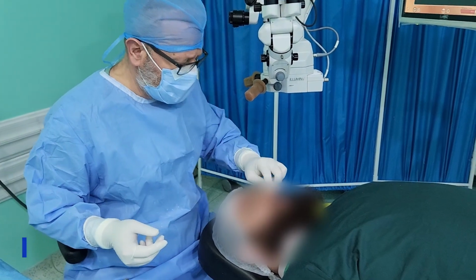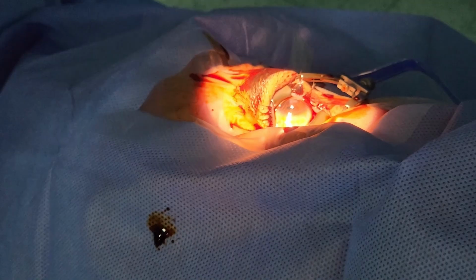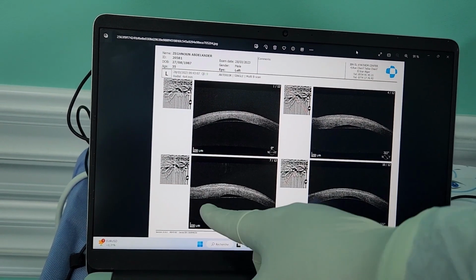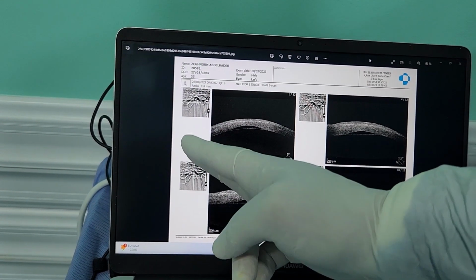The treatment chosen in this case is mainly surgical. Two vertical deep corneal sutures were performed under topical anesthesia to bring the edges of the Descemet and/or the Dua's membrane horizontal rupture closer together.